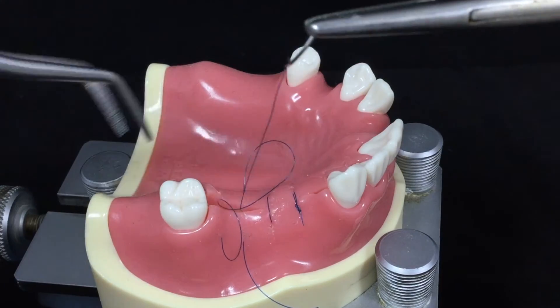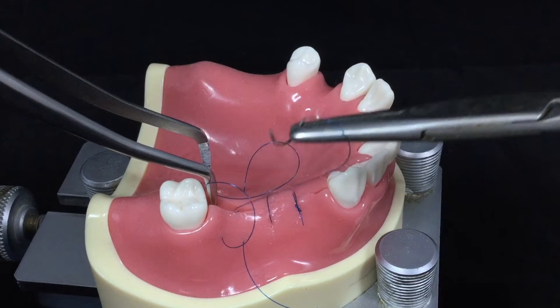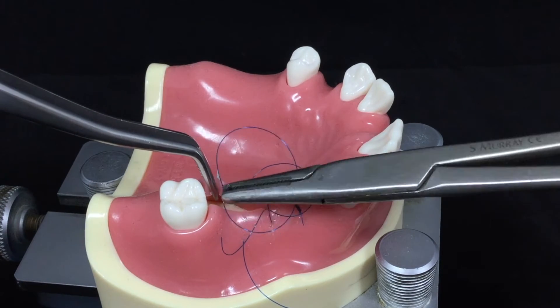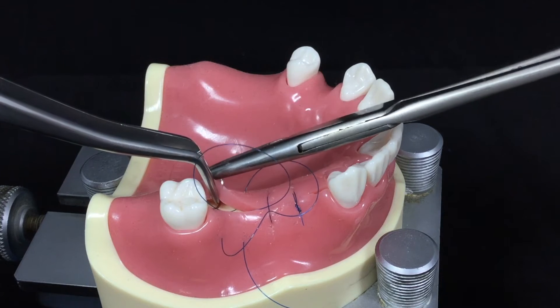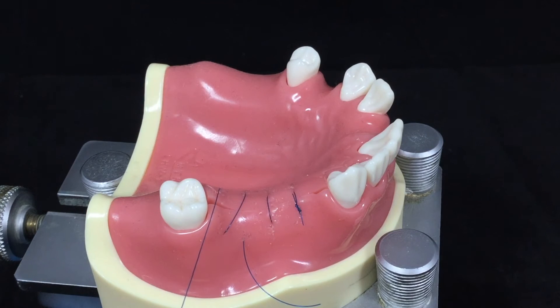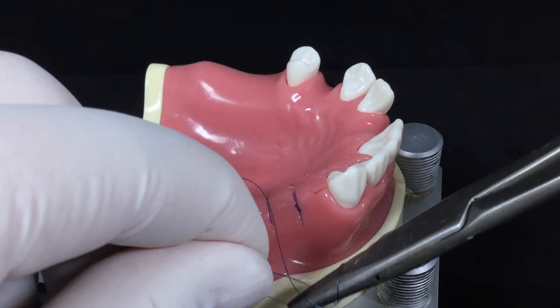But unlike the horizontal external mattress suture, you engage the lingual flap from mesial to distal direction, not from distal to mesial direction. So you repeat the mesial-distal directions and eventually you get the large cross mark created over the incision line.